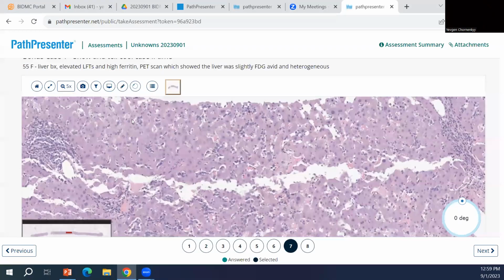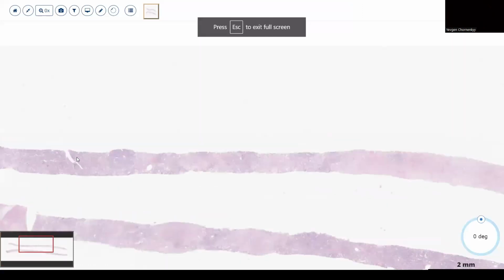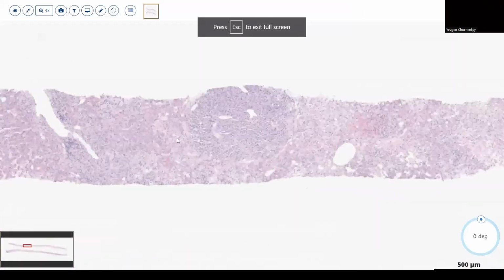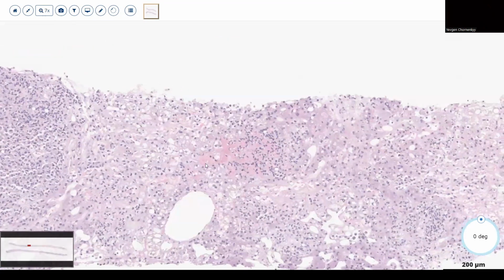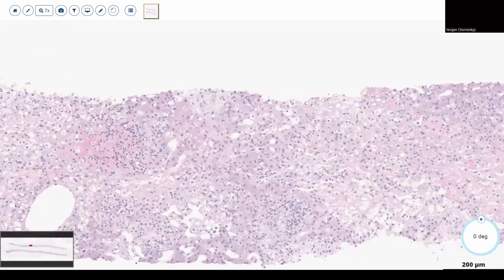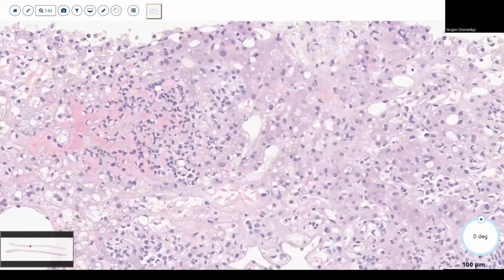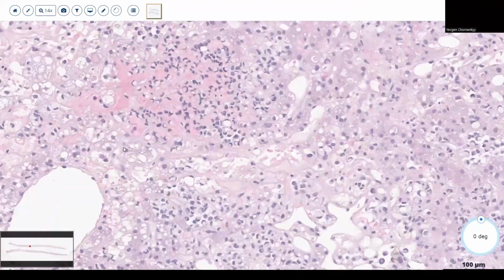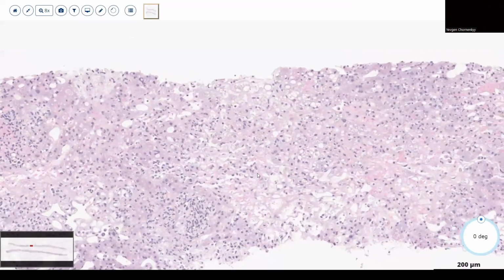And then another case right here. Again, also super cool. Not good for the patient, but anything we think is cool is not good for the patient. Similar story, but what are these? What kind of differentials do you want to think about with those? Invasive lobular carcinoma.